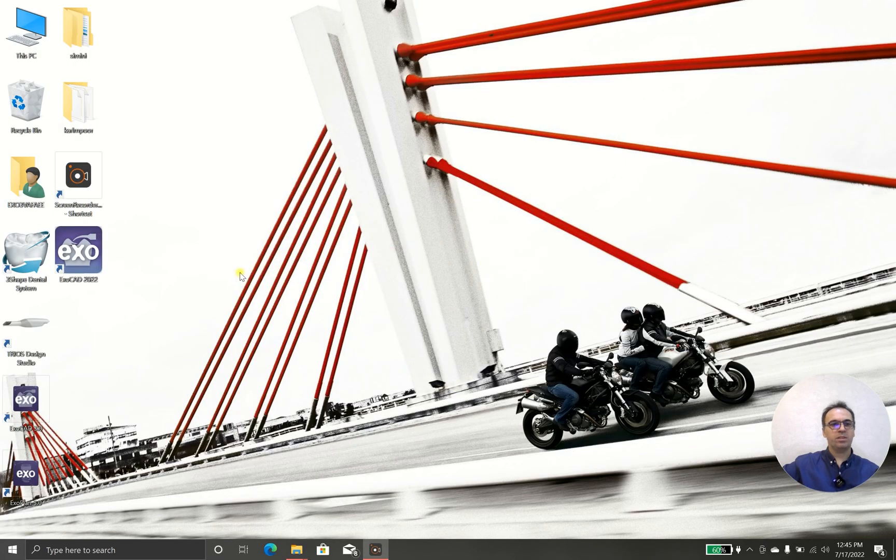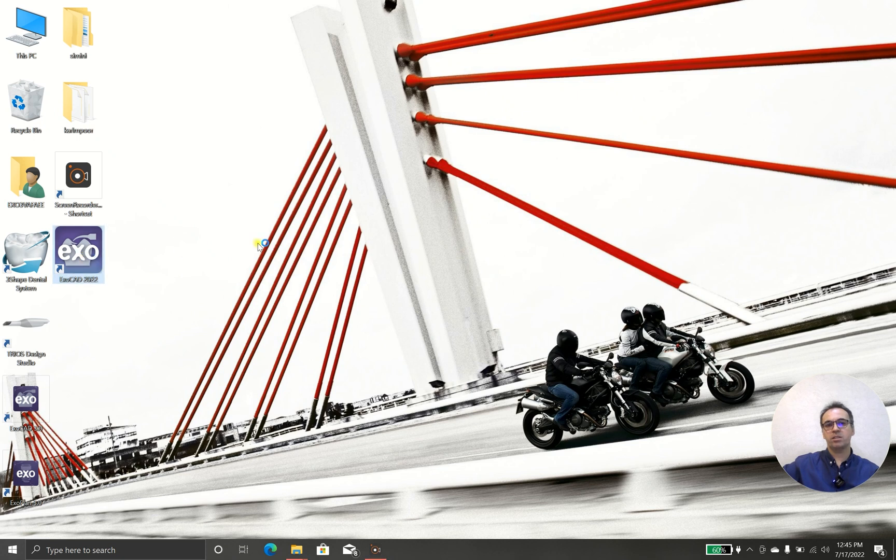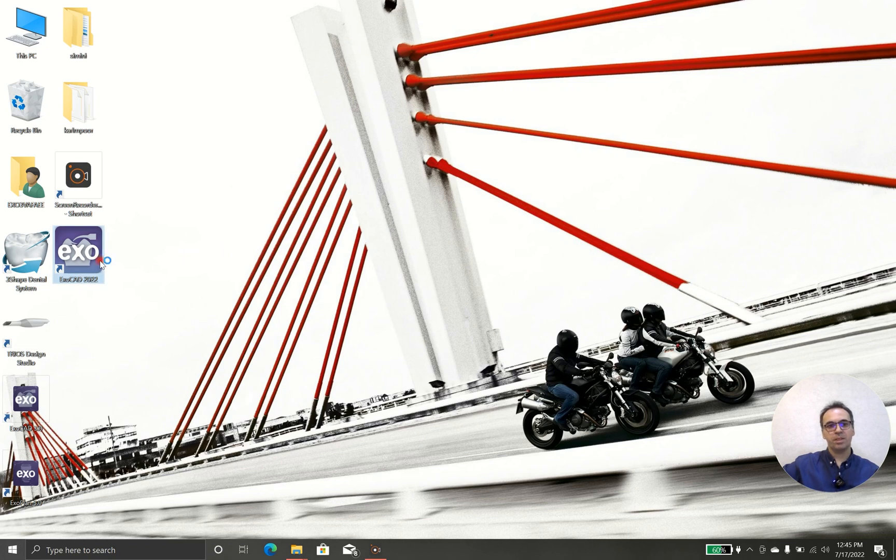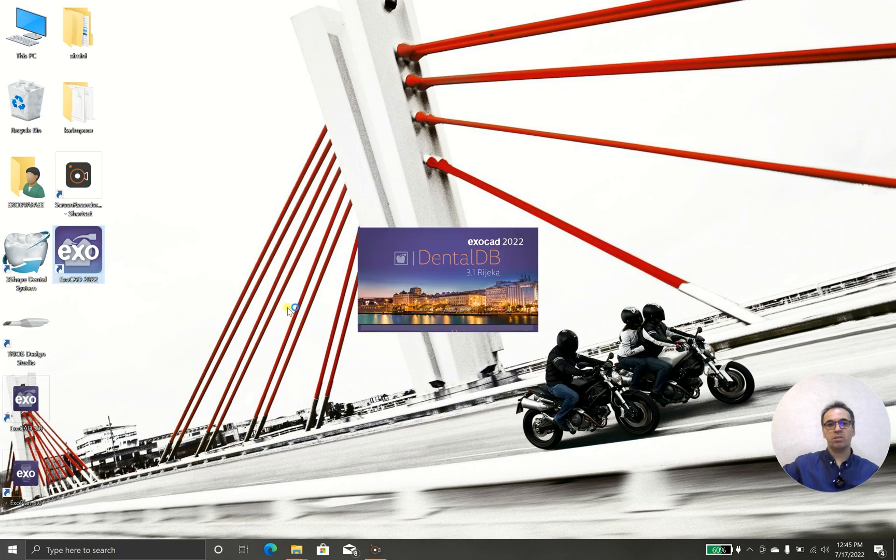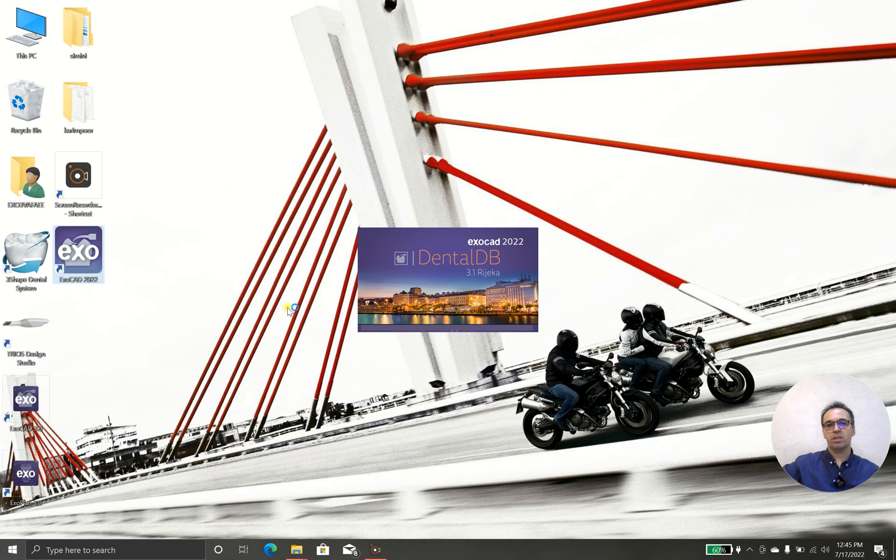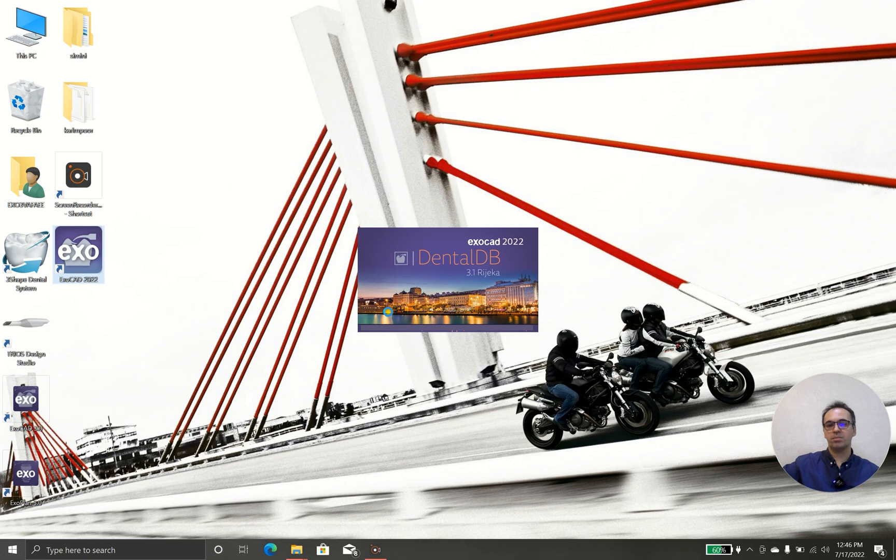Hello everybody, today we have Exocad 3.1 and we are so excited because we have the latest version of software. Today we are going to design two laminate veneers with Exocad 3.1 and we will tell you what's the difference between this version and the last version, 3.0.